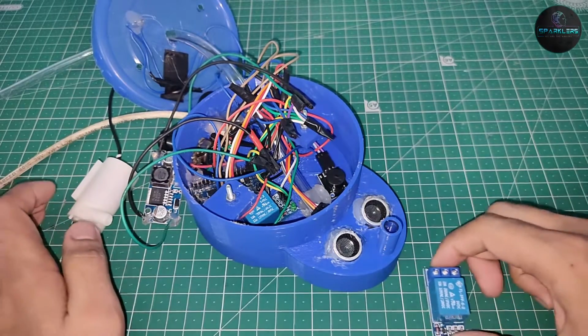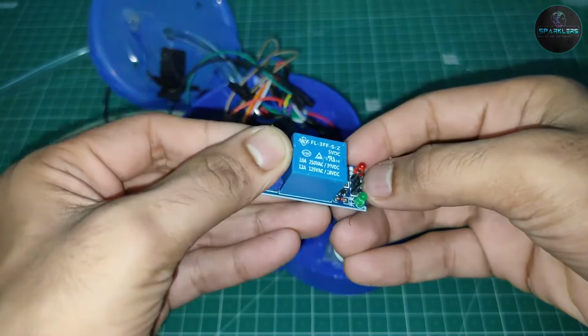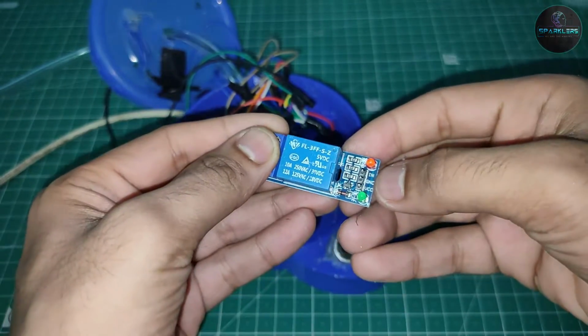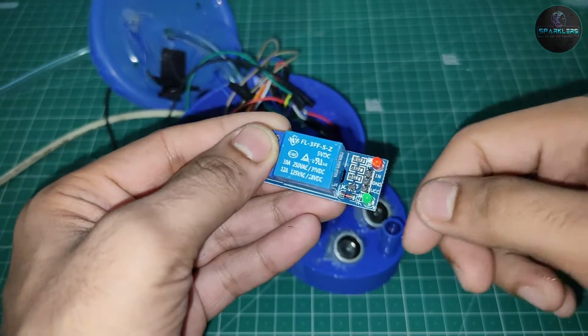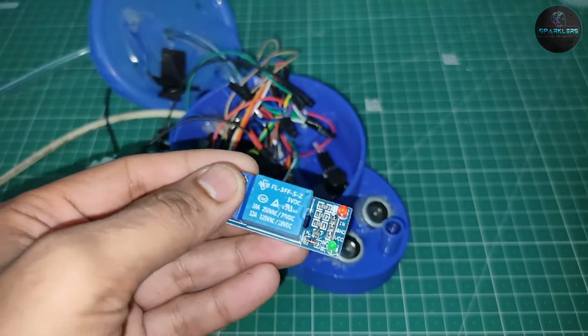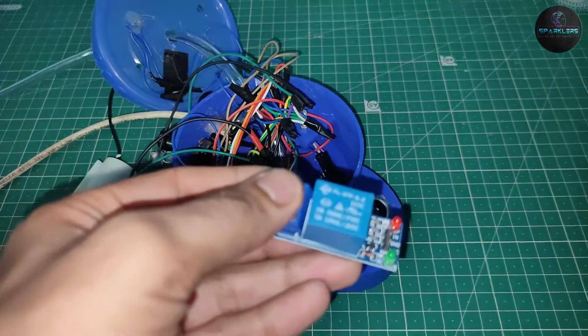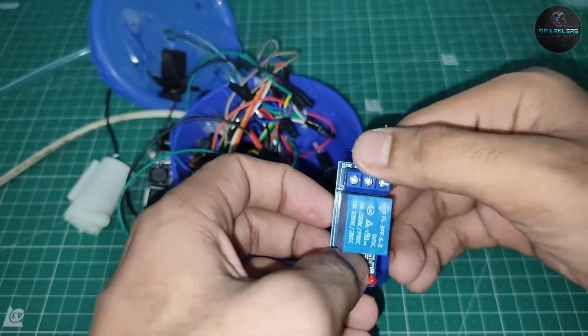Now in a relay, if you see, there are 3 pins here which you use to power the relay. In between these 3 pins there is a VCC and ground. So connect the VCC with 5 volts, connect the ground with ground, and there is an input pin. Connect this input pin with any of the digital pins in Arduino. In my case I will connect it to pin number 6. And there are 3 outputs here.